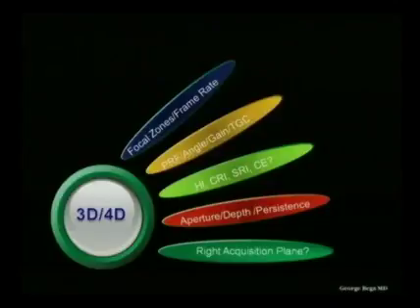PRF, angle, gain, and TGC are also important, especially if you're using color and power Doppler, as these settings are so important in first having the right sensitivity to get the vessels, and number two, they will actually be a problem in a volume because, especially angle, I may have the right angle for one vessel, but if I'm after a number of vessels, I would have to account for their orientation in a volume. So this will require some thinking and some analysis before the acquisition.